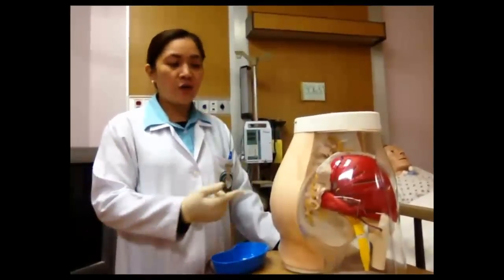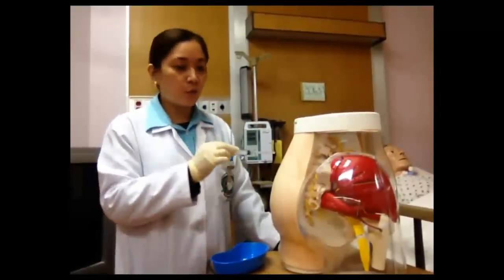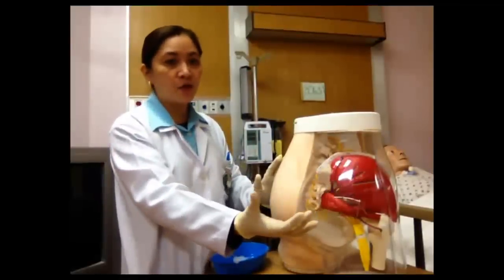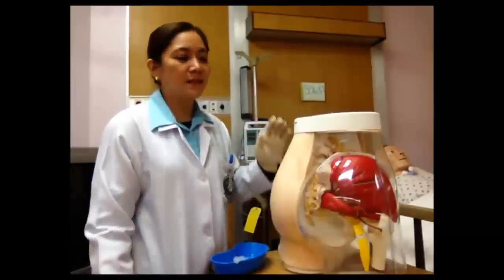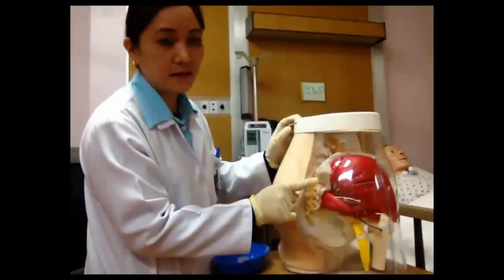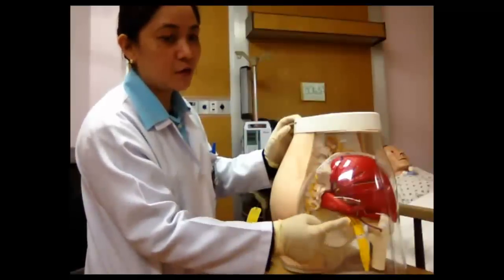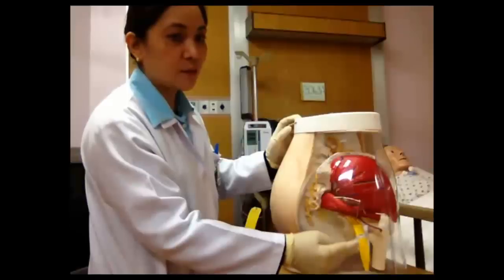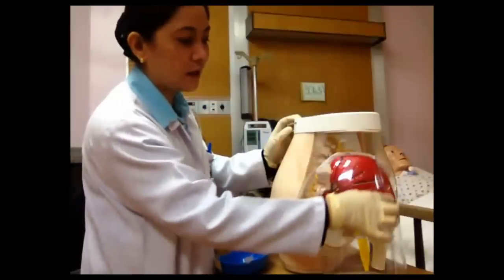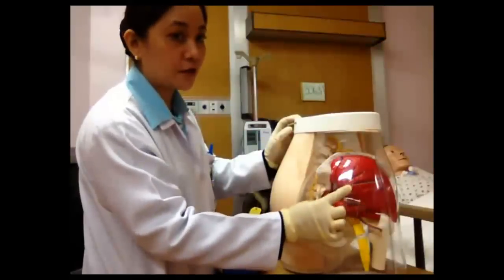Here I'm going to show you how to inject into the gluteal muscle. If the medication is more than 2 ml, we have to inject it into the gluteal muscle because this muscle is quite bigger than the deltoid muscle. As you can see in a transparent buttocks, the red muscles that you can see are the site of injection. We have to avoid that yellow nerve, which is the sciatic nerve, because pricking this nerve can cause paralysis to our patient. So only in these red muscles, these are the safe areas for injection.